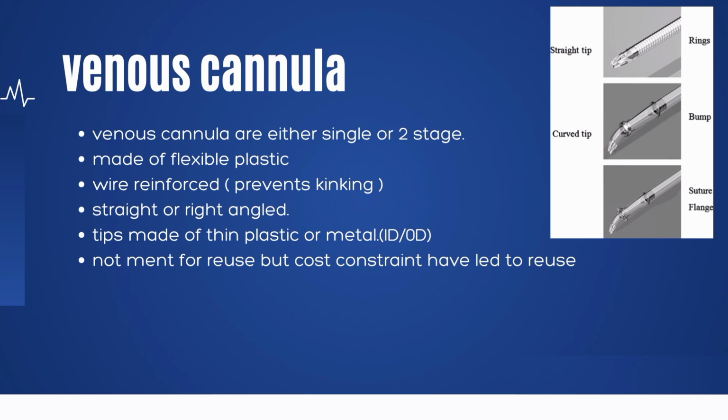Challenges: excessive pressure, excessive drainage. Excessive venous drainage can be problematic. It may cause chattering or fluttering of the vein. It will reflect on the venous line. There are sudden movements in the venous line.